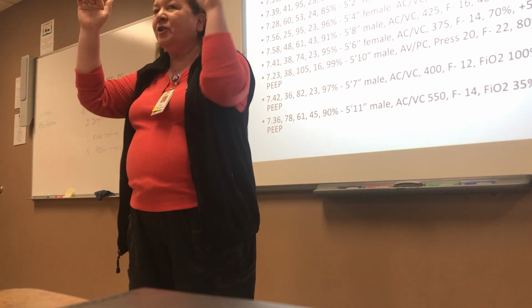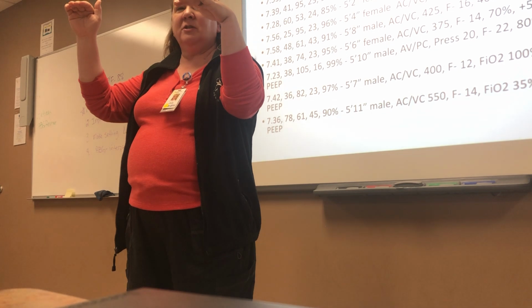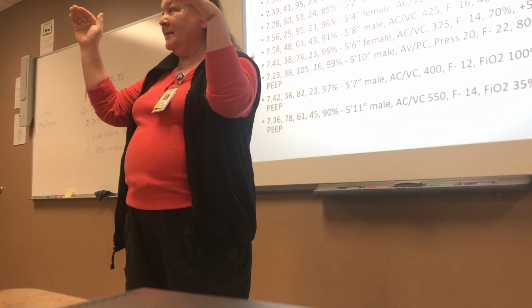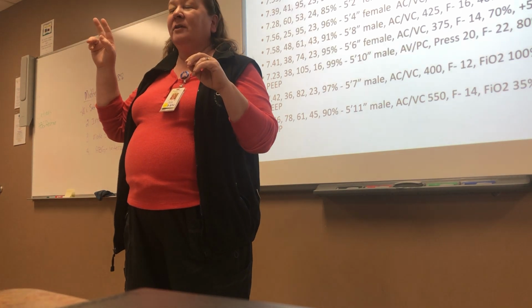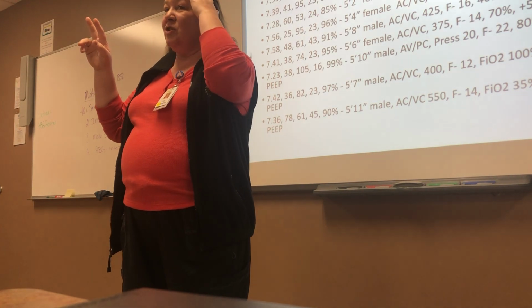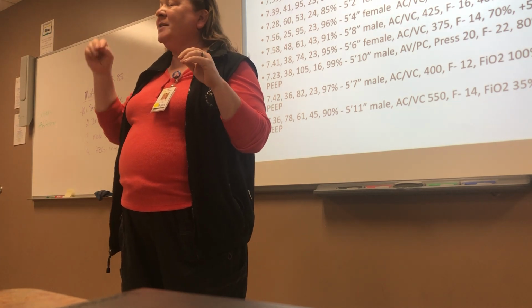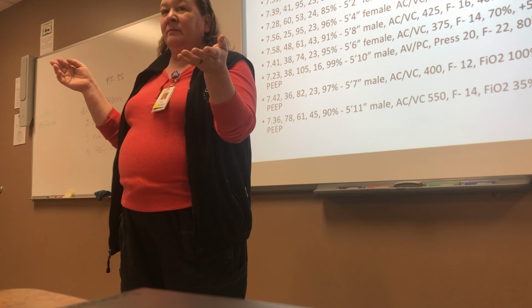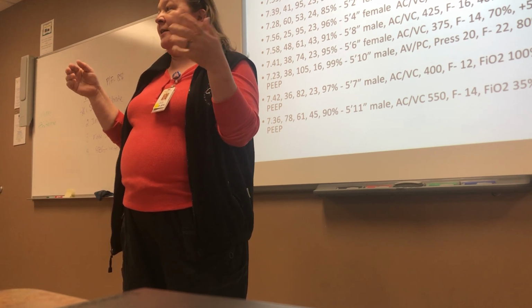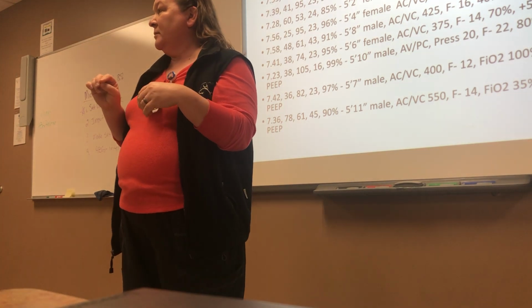Then you would go 600 and 300. 100 above the range, 100 below the range. Does that make sense? If your number is 2 digits, like peak pressure is 20, you would go 10 above and 10 below 20 for your range. And then PEEP and minute ventilation and those numbers that are only one solid number, it's 2 above and below.